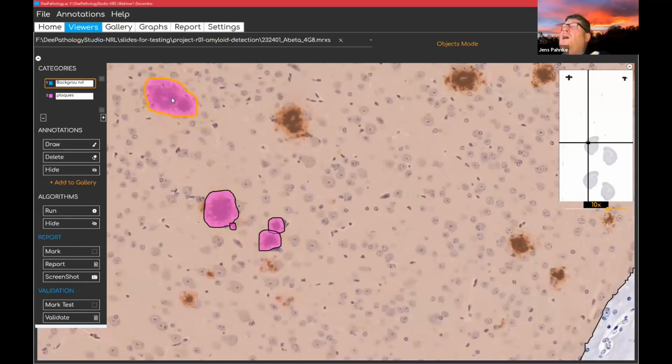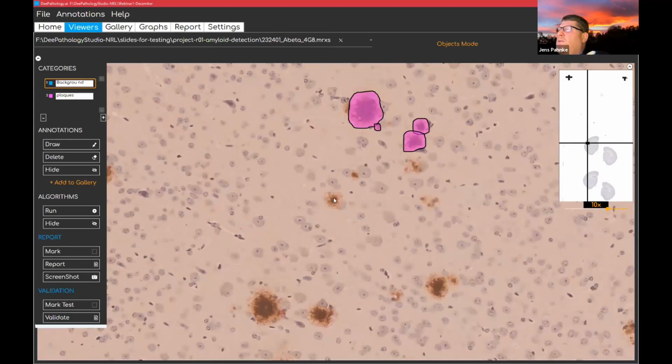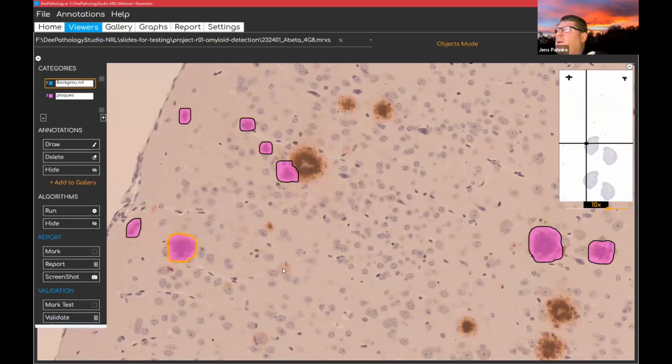That's a big one that I don't like because it's double, so I take this away. Usually that's the easiest way to delete this. So like this, and only choosing the ones that we are really keen on and we think this is perfect. I'll go on here. Here's a very big one. Don't take this one, take this one, take this one, take this one. This is some diffuse deposit.